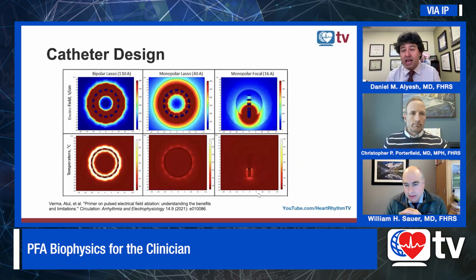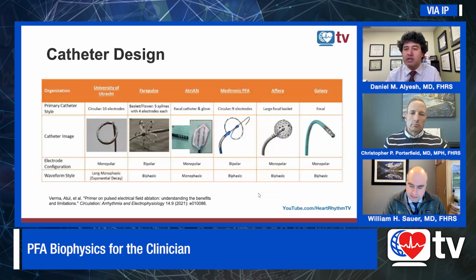Moving on to catheter design. Chris, I'll pose this question to you. So you have monopolar, bipolar, circular catheters, focal tip. Talk to us a little bit about what goes into a catheter design and the importance of monopolar versus bipolar designs.